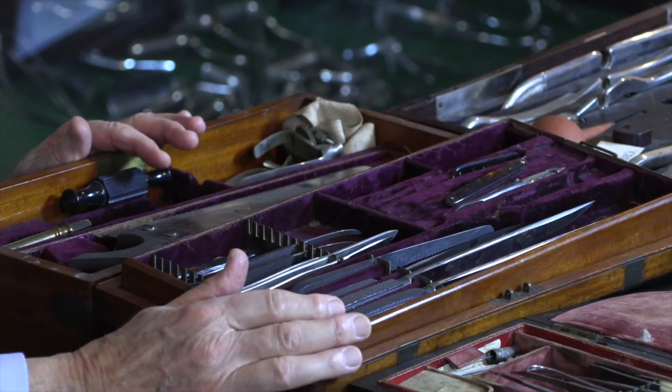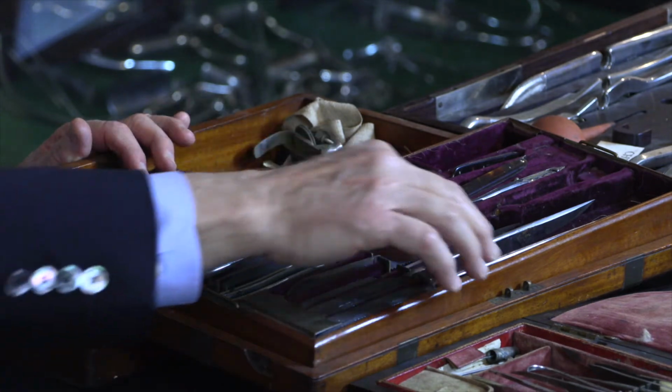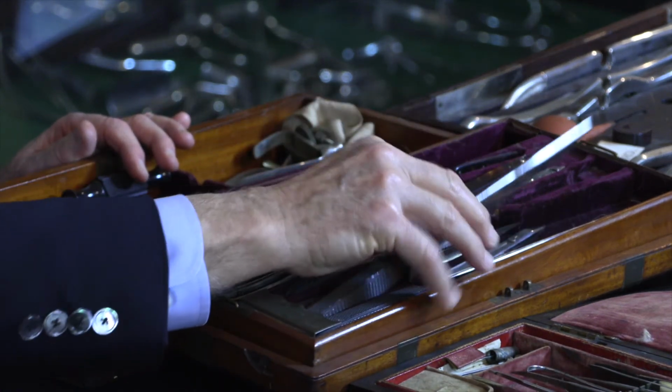During the Civil War, with any injury to a leg or an arm, the limb would get gangrenous, and the bacteria would spread throughout the body, and very shortly after, the patient would die. So amputation was a big thing. Right away, if there's an injury of the leg, the first thing they do, they amputate that leg. And this is an amputation set. As you can see, it's a little bit gross, but that's how they did it.